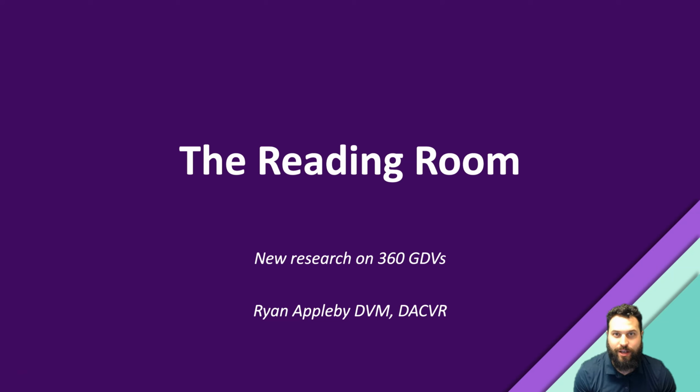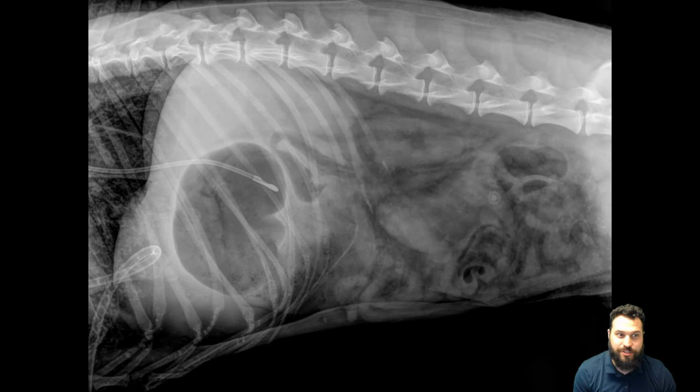I'm super excited for this week's case to go through common cases in small animal practice to help you level up your radiology game. I'm talking about new research on 360 GDVs. This is the case that we gave in the Weekend Rounds newsletter a couple weeks ago and asked our readers to decide, what do they think is going on in this? And as I'm sure you can guess based on the title of this presentation, the answer is actually quite surprising.